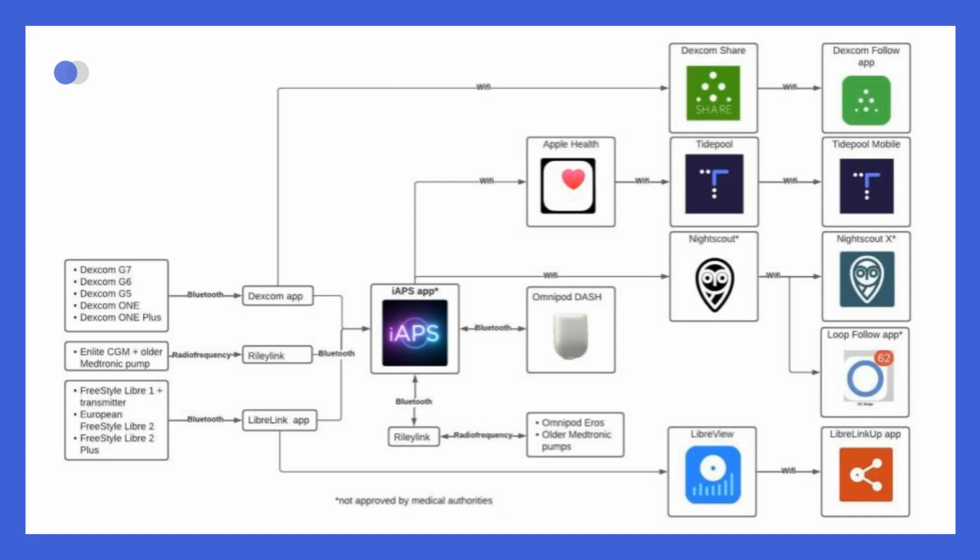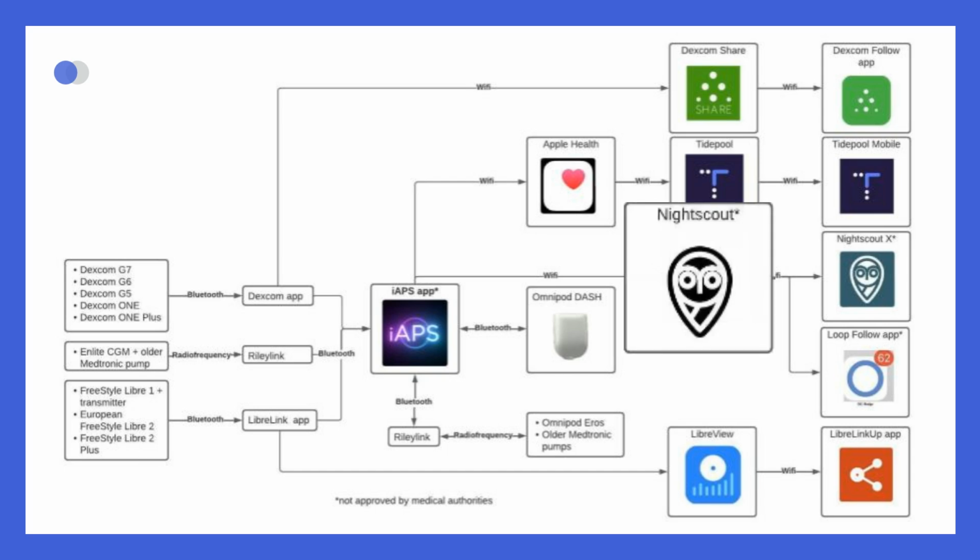Nightscout enables real-time tracking of your sensor and insulin data, allowing you to share it with your loved ones or healthcare provider. Additionally, Nightscout is the exclusive method for generating reports from your iAPS automated insulin delivery system.